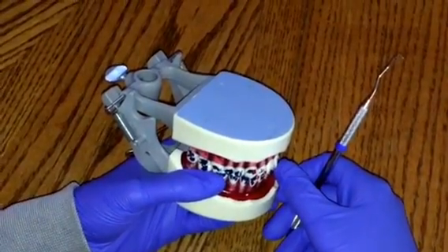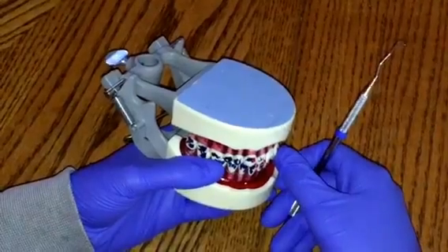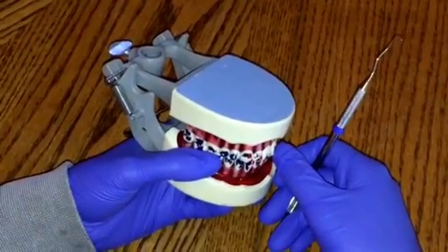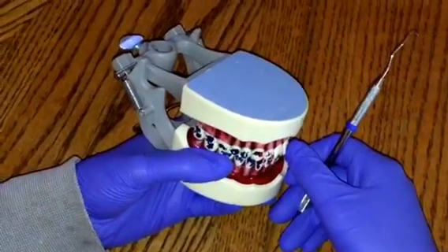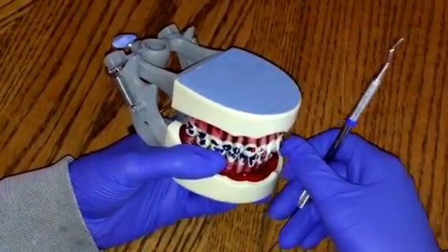Hello. Today, a student will be utilizing the Extended 11/12 for their proficiency. Gracie, I would like you to demonstrate this instrument on number 30 facial and number 8 surfaces away from the facial. Remember, this is a graded proficiency and I will not be able to communicate with you until after you are finished. When you are ready, please begin.